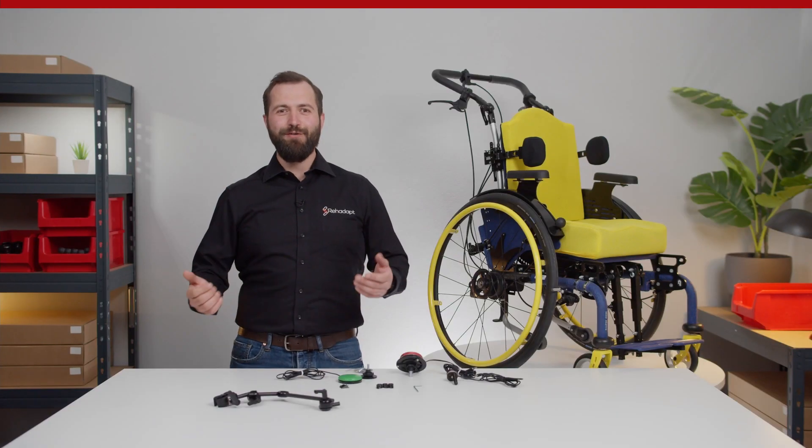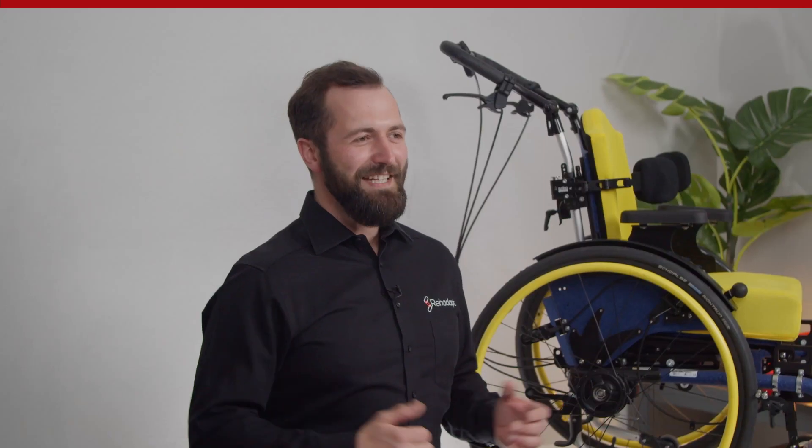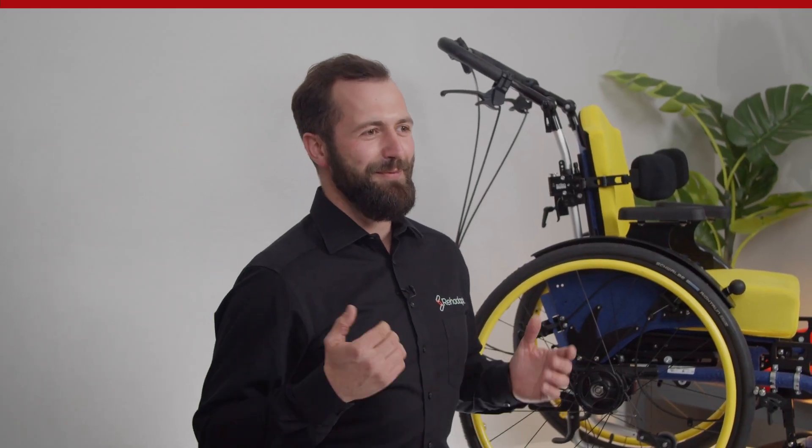Hi, and welcome to a new episode of Mounting Made Easy. I'm Robert from Rehadapt. In many of our previous episodes, we presented various wheelchair mounts for AAC devices that are controlled via eye gaze.